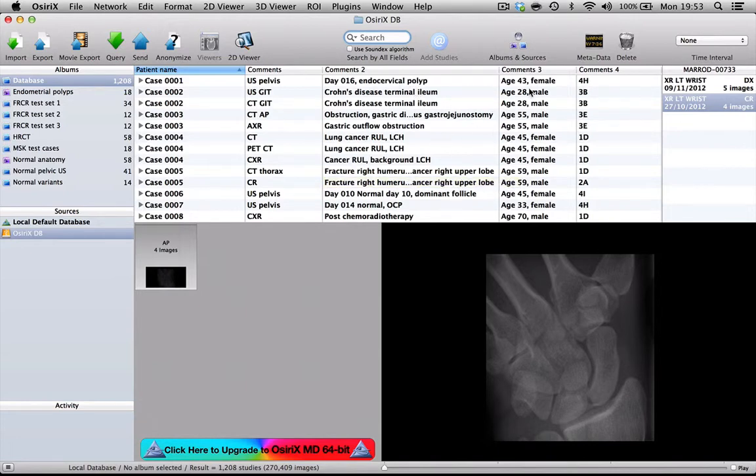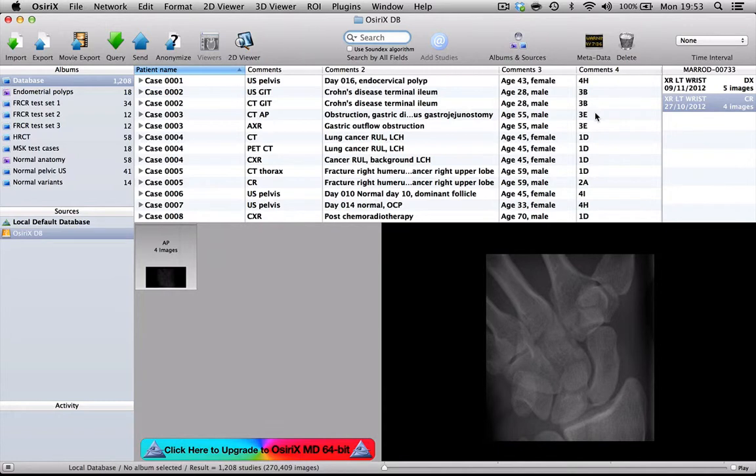I use a separate column to record the patient's age and sex, and I use a final column to code the module of the RCR syllabus that the case falls under.